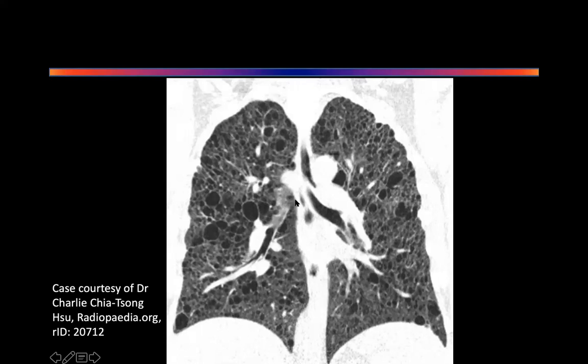It's a very basic description, but it tells you something. What do you think is the diagnosis here? Multiple cystic lesion of lung. Just wait. Let this group say.